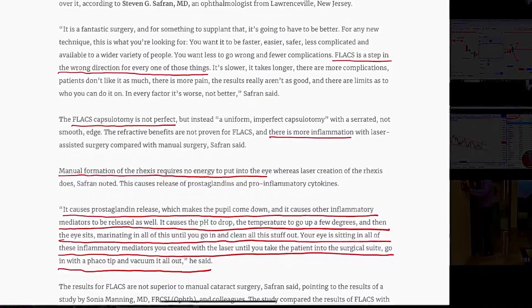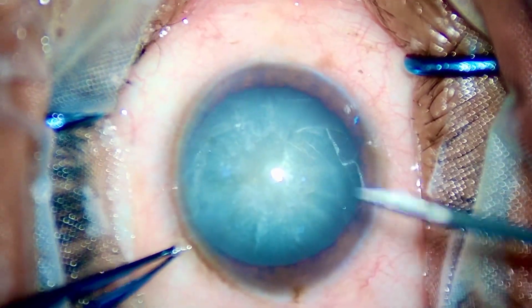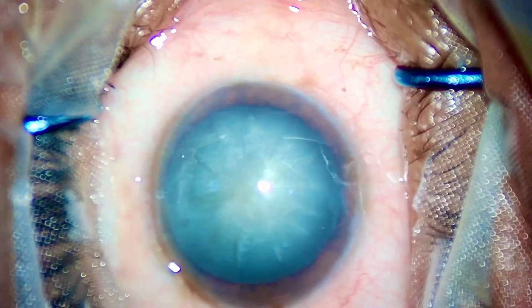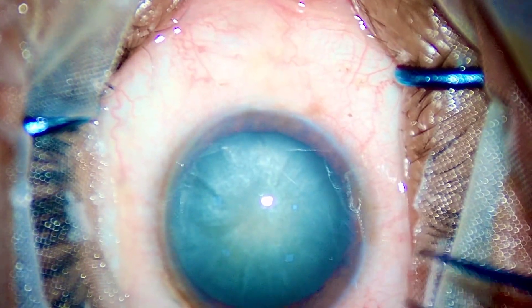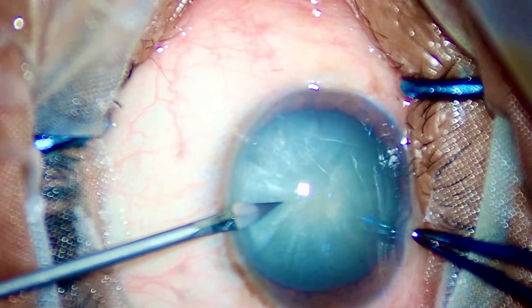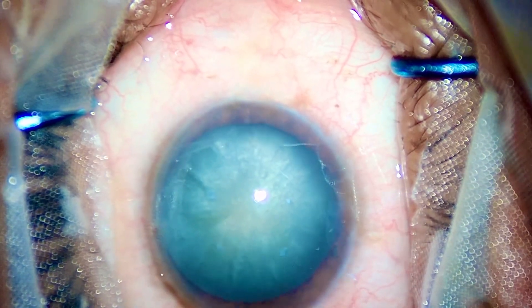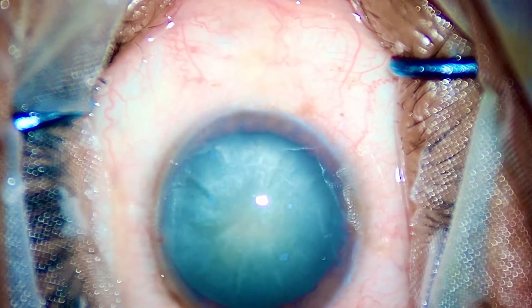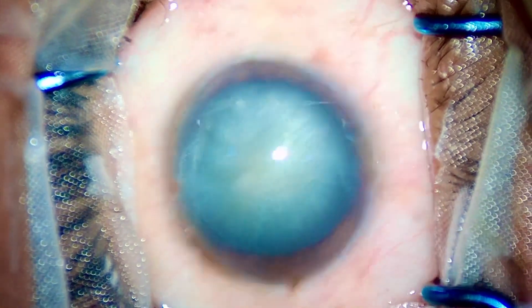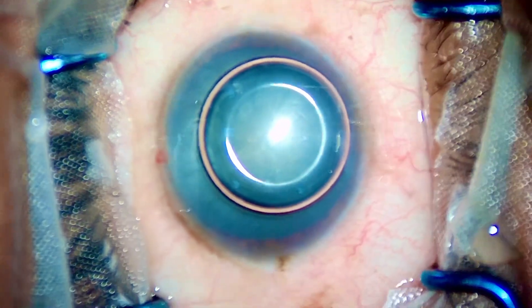You can just pause this video and read this article. Now I'll be starting a white cataract case and tell you what the major differences are. As you can see, I have a white cataract in front of me, and why is FLAX a famous technique?